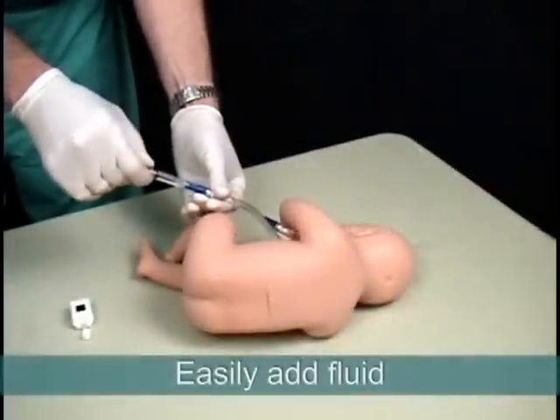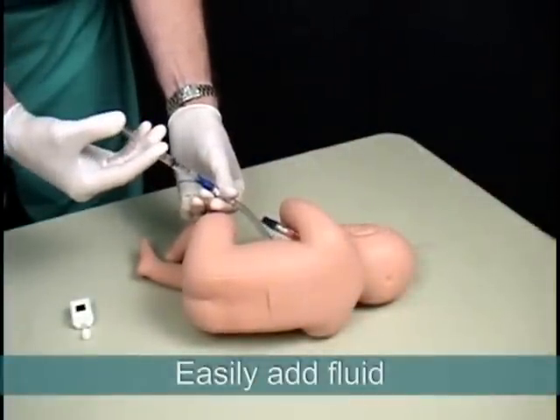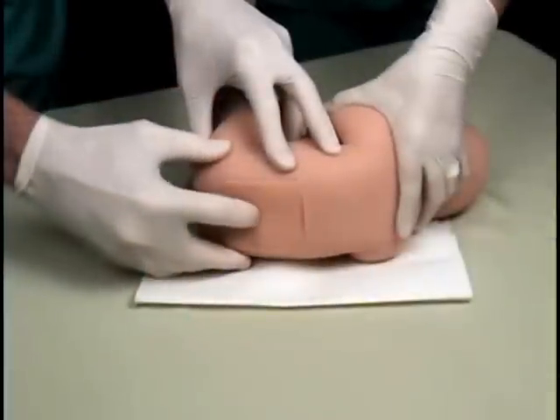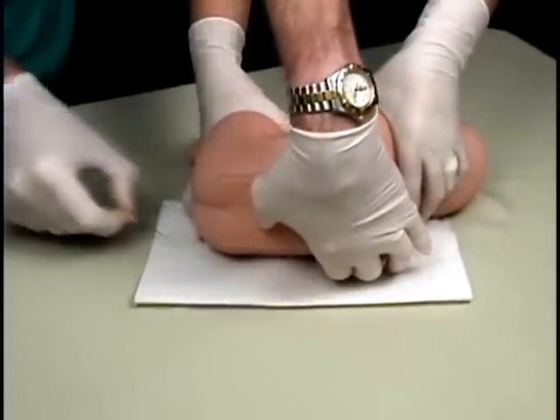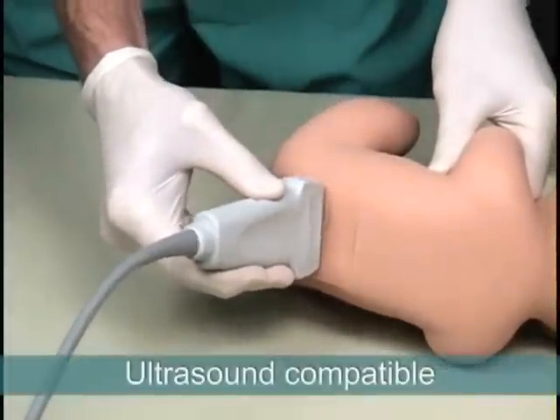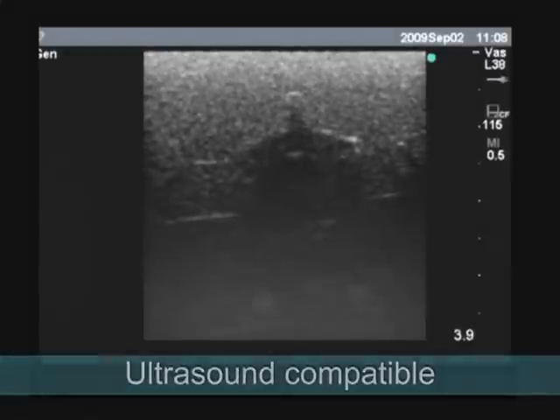If fluid levels become low, they can be easily refilled using water or the included red fluid. This trainer's replaceable tissues are durable for multiple uses and they are self-sealing, so repeated procedures will only leave minor needle marks over time when viewed under ultrasound.